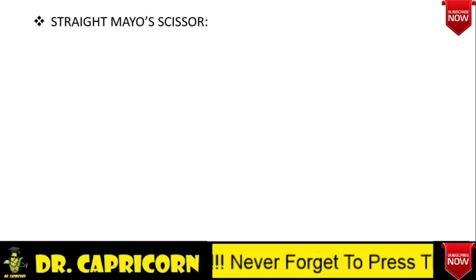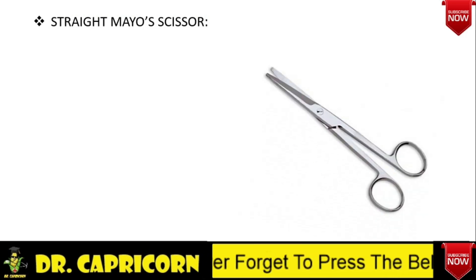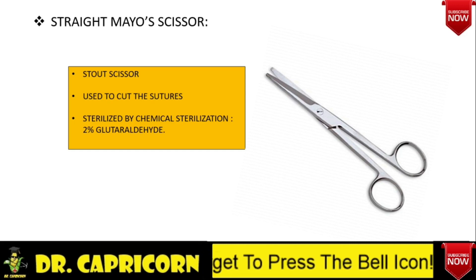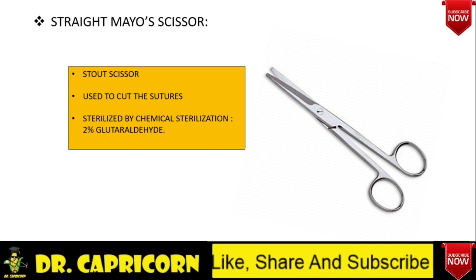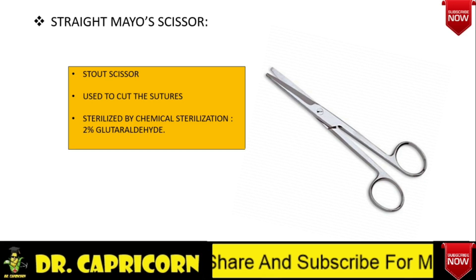The first is Mayo scissors — it is a stout scissor. To describe this scissor: there are two rings, a handle, there is no ratchet, a screw joint, and there are two blades without any teeth. There are two types of Mayo scissor: one is straight, and the other is curved. The straight Mayo scissor is also known as suture cutting scissor, and it is used to cut the sutures.